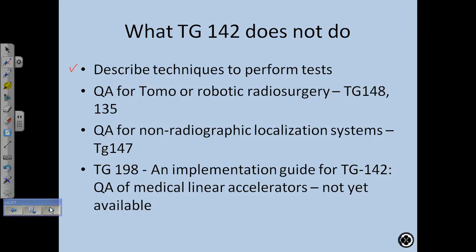Well, where do we learn how to do these tests? That's a challenge, because when 142 came out, people were like, oh, that's nice, but what do I do about this? TG198 was formed to address that issue. This is not even out yet. It's still in press, still in the works. TG198 is an implementation guide for TG142 QA of medical linear accelerators. Not yet available, guys. So what do we do now? It's not available. What do we do?